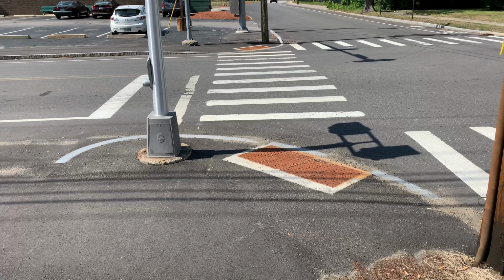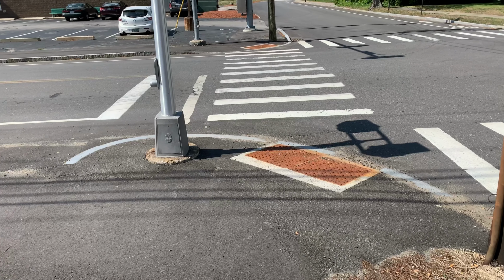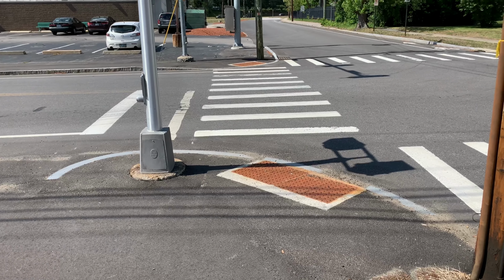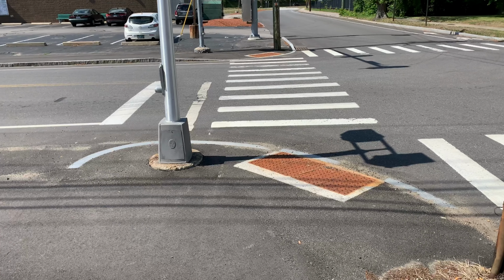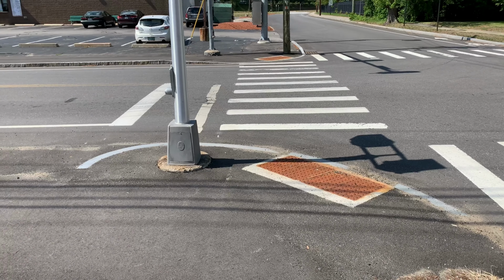And another few things I want to point out that can be cues that you come up to a corner is you can also, or sometimes, feel the change in the wind when you walk past buildings. So especially in kind of a city downtown area, when you walk past a building or there becomes an opening at a corner, you can feel the change in pressure or the wind.